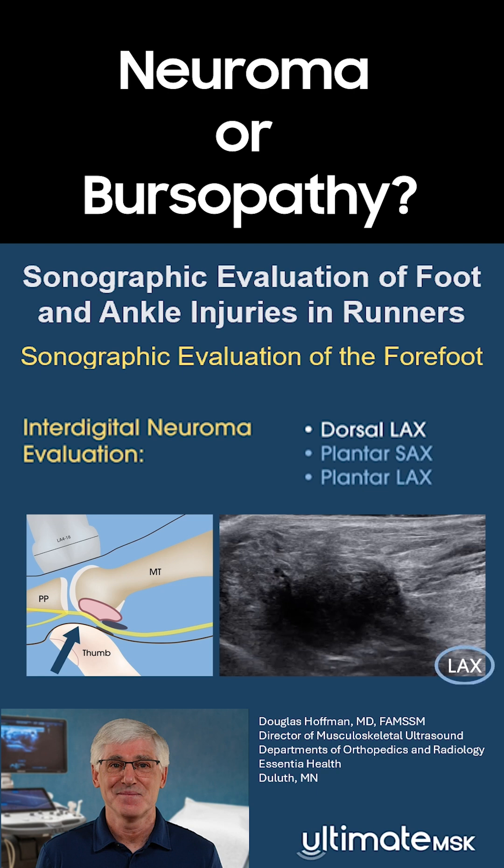The long axis cine clip on the right shows the third metatarsal interspace in our patient. Initially, the hypoechoic mass within the interspace is difficult to distinguish as either an interdigital neuroma or intermetatarsal bursopathy.